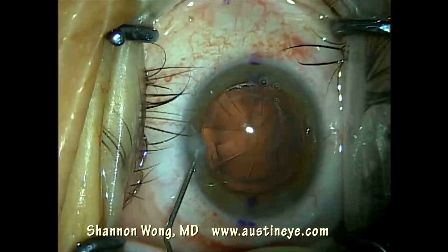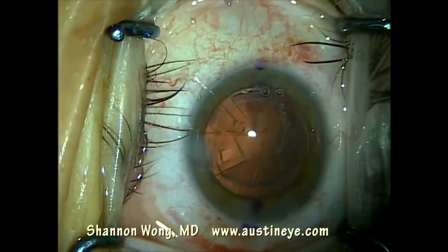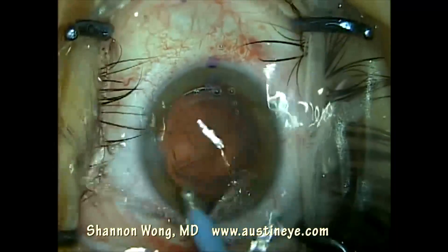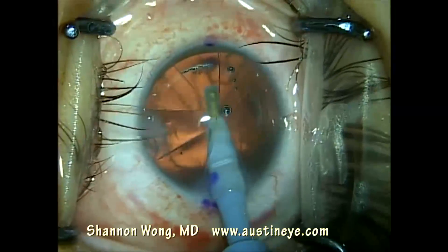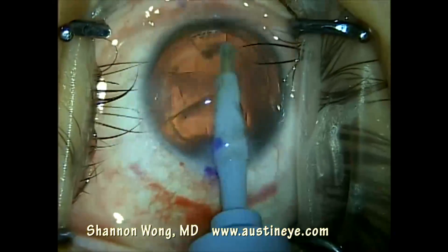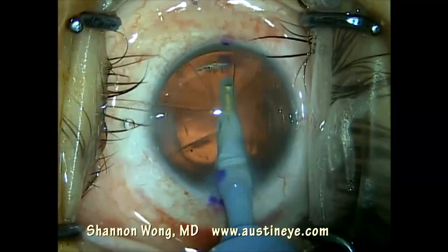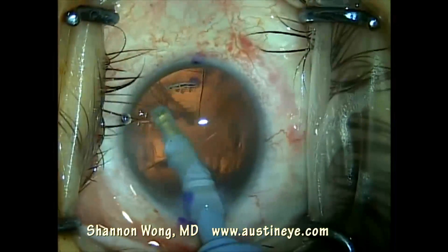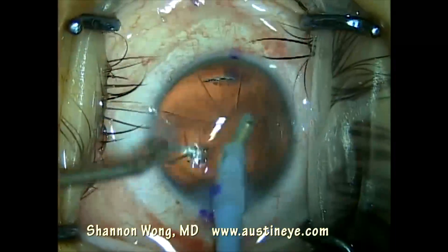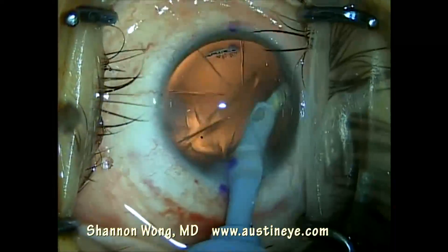Now that the central nucleus has been removed, we stromal hydrate the secondary incision to perhaps improve the stability of the anterior chamber during irrigation and aspiration of the cortical remnants. I use a silicone-tipped irrigation and aspiration instrument made by MST Microsurgical.